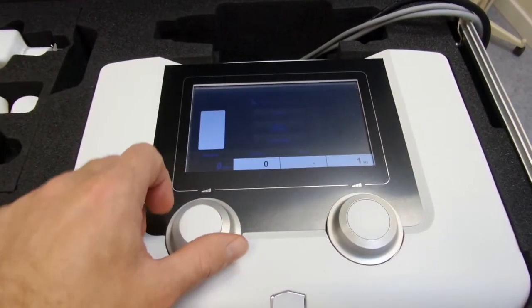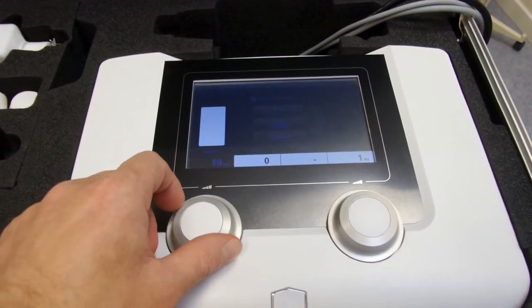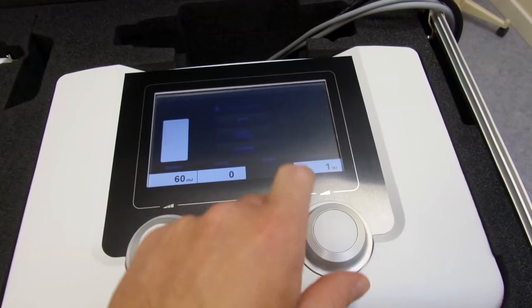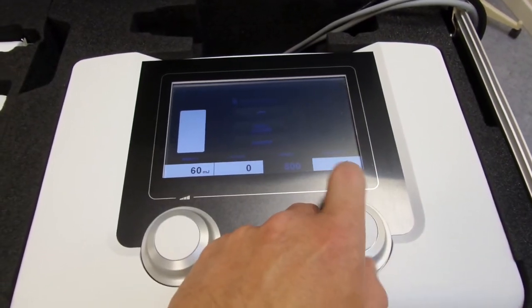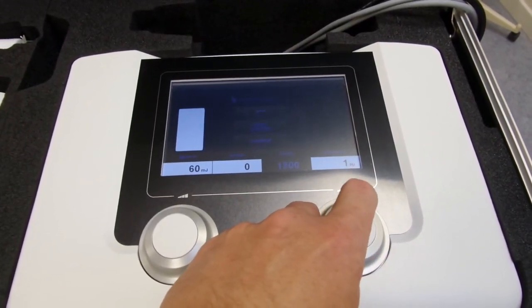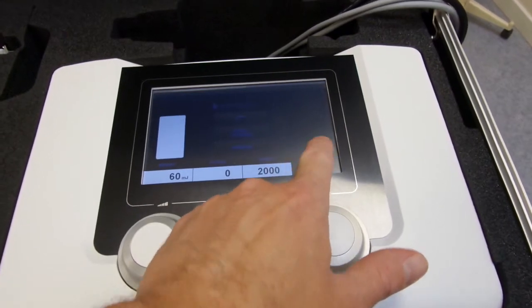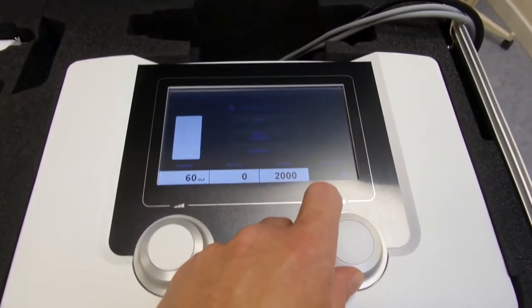I'm going to go ahead and do the settings. We want 60 millijoules. We're going to do 2,000 shocks and we're going to do that at 10 Hertz.